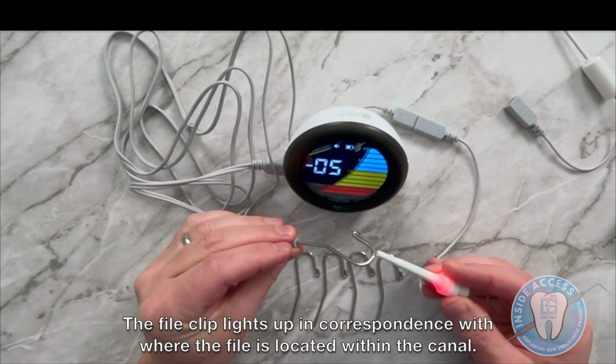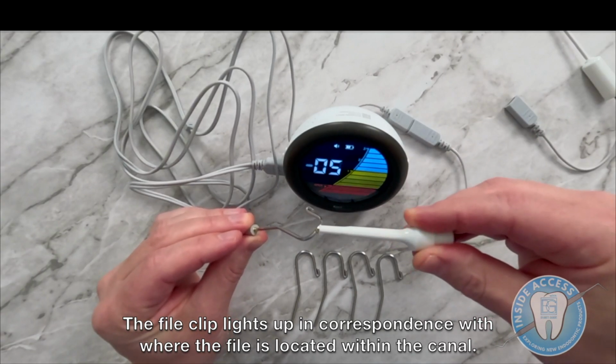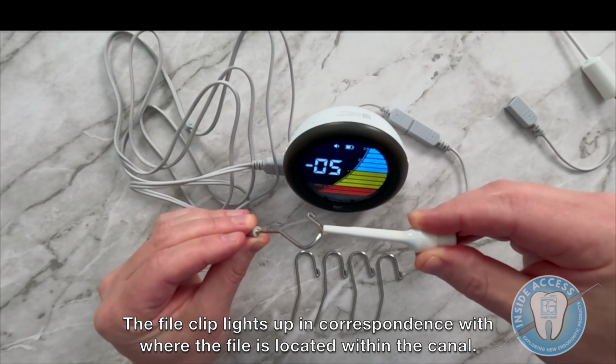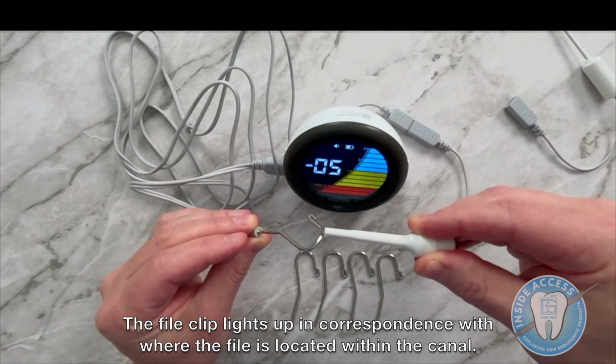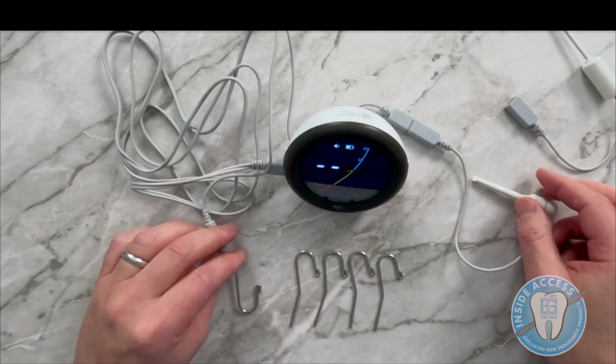So when you'll see this, you see that the little file clip is actually lighting up in correspondence with where you are. So red being out the apex, yellow being right on the money, and blue being that you're still more coronal. Okay, and we'll demonstrate this in just a moment.